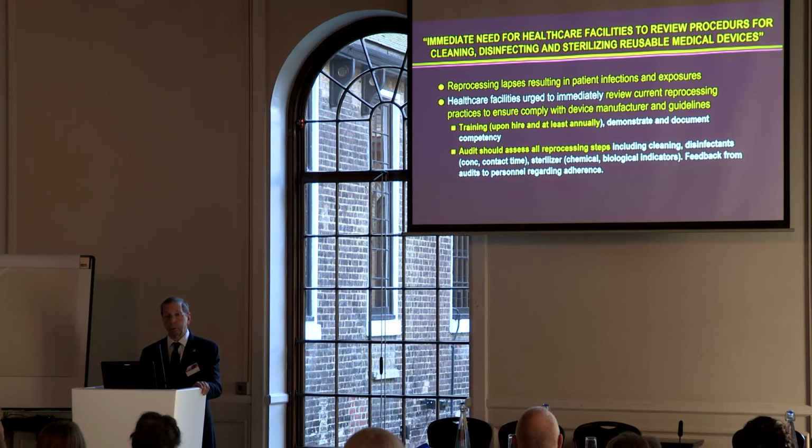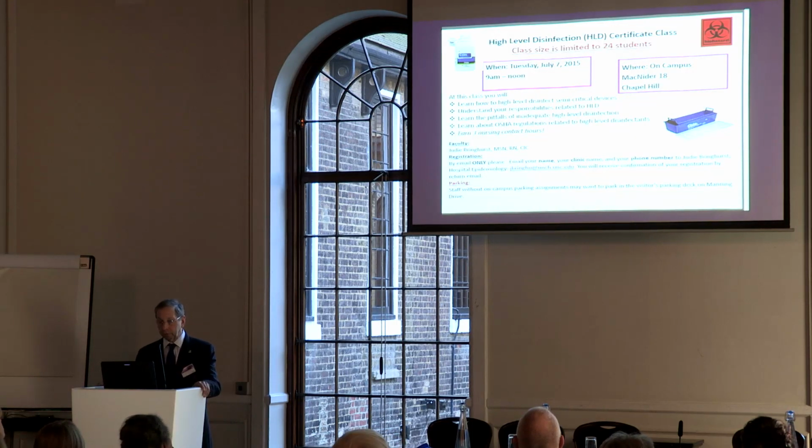At our institution, at my hospital, this is just an example of what we do. Class size is limited to allow a lot of interaction between our infection preventionists and the people we're training. You can see it's a multi-hour class. The initial training is the longest, but each year the training is extensive. And then in addition to the training, there's on-site observation. So it's not enough just to train them in a classroom setting, but they must demonstrate competency to an appropriately trained supervisor under direct observation at least once a year.